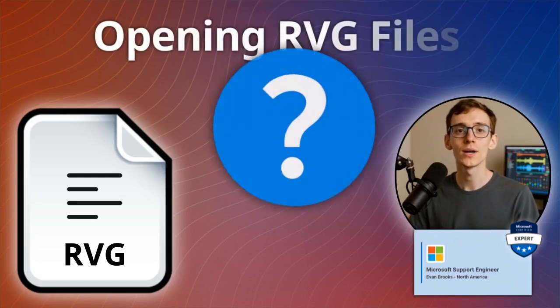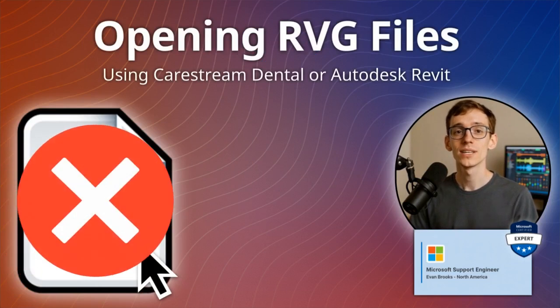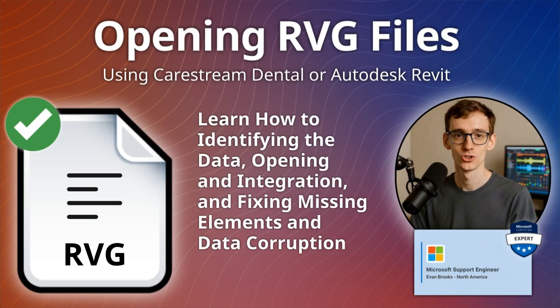You will most likely find the RVG extension being used for radiovisiography dental x-rays or as a Revit external group file. This format acts as either a high-resolution digital radiograph for oral diagnostics or a modular data block for 3D building information modeling. I'm Evan Brooks, Certified Support Engineer.